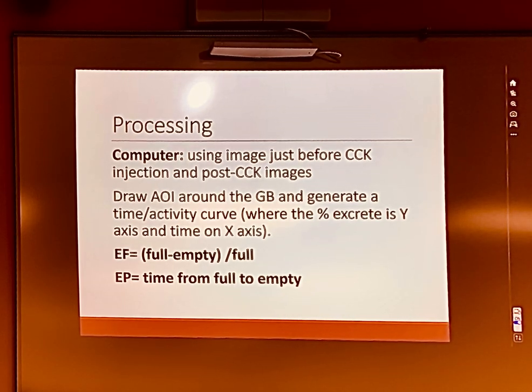The way that you calculate this is ejection fraction equals your big number minus your little number, divided by your big number.